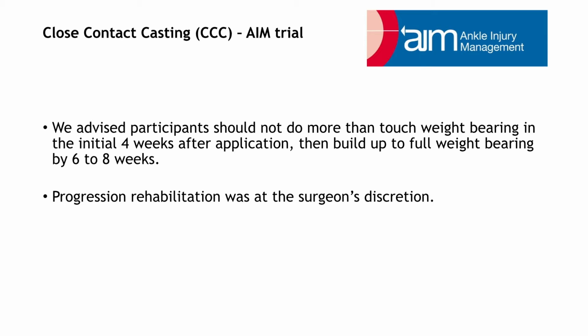We advised that there should be no more than touch weight bearing in the initial 4 weeks after application of the close contact cast, and then to build up to full weight bearing by 6 to 8 weeks as healing allows. Finally, as a pragmatic trial, the progression of rehabilitation during the AIM study was at the treating surgeon's discretion.